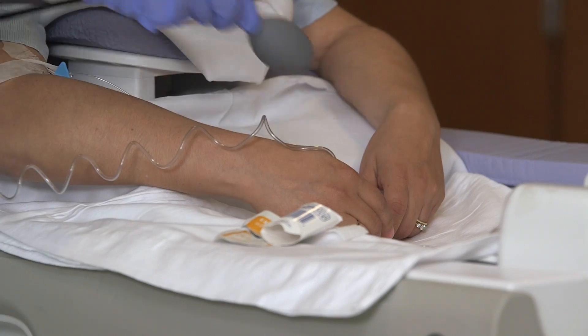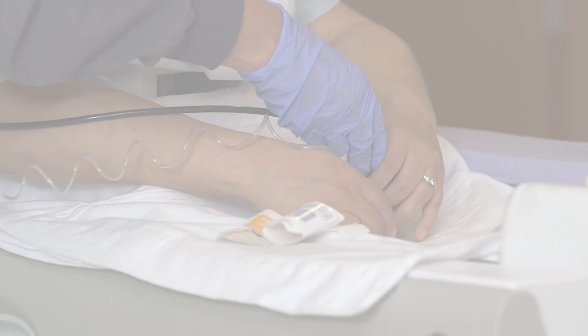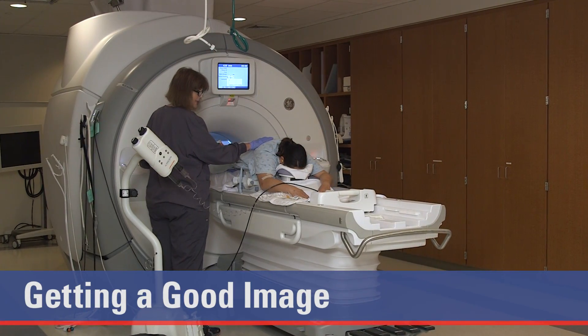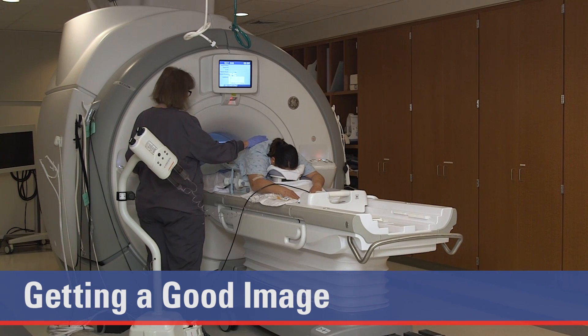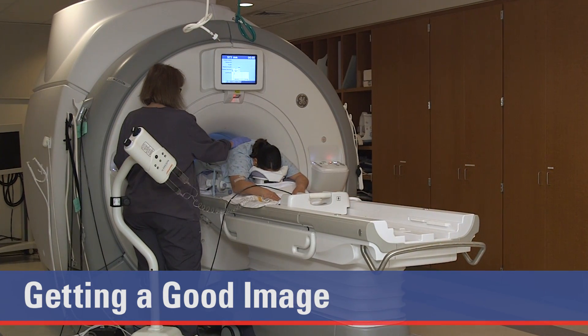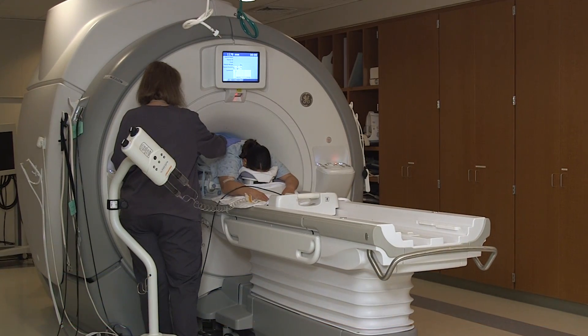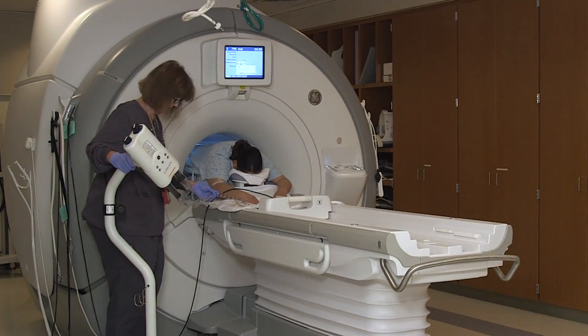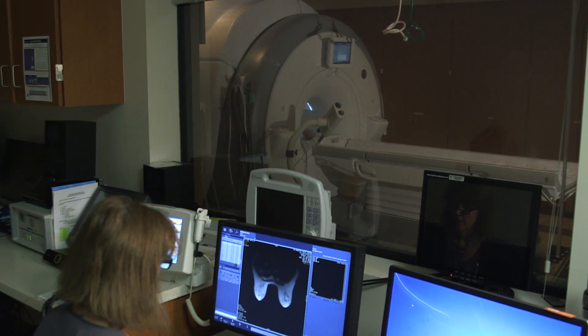You also can squeeze a special ball to alert the tech if needed. The key to getting good images is to relax and breathe normally. Try to lay still during the exam. Do not lift your head because this will cause your chest to move. The technologist will work with you to find a comfortable position so you can relax.